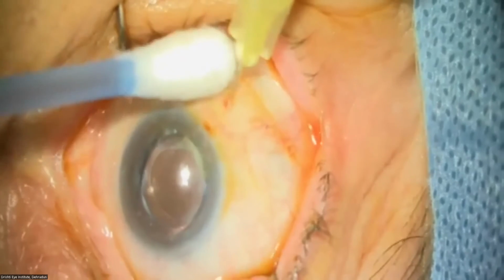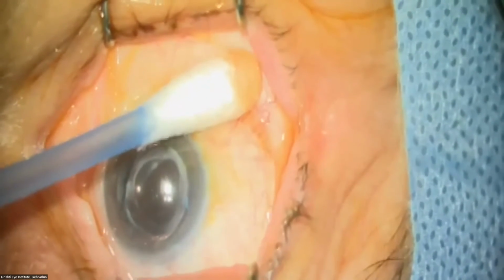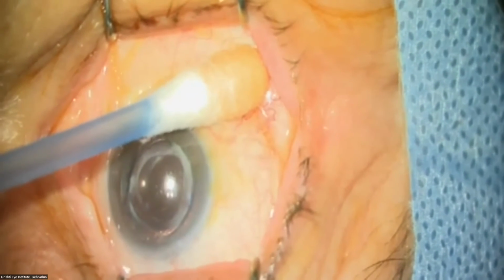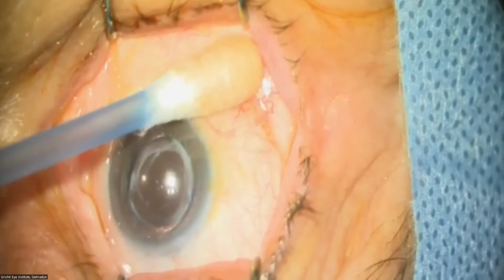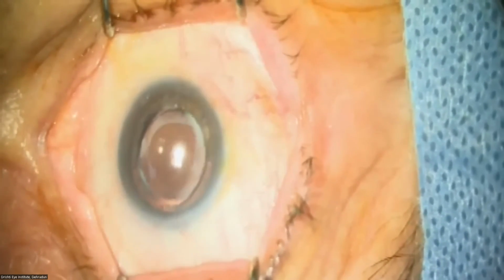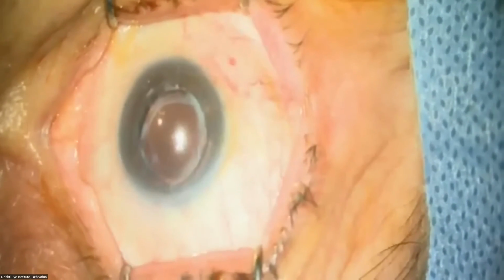And then with a cotton tipped applicator, you will see this movement, that it just blocks the extrusion of drug, or the reflux of drug, from inside the vitreous cavity, and I keep it plugged immediately for at least 30 seconds, 30 to 45 seconds. And this prevents any extrusion of drug. You can see that there is no extrusion of drug from the site of injection. And then antibiotic drops are instilled.